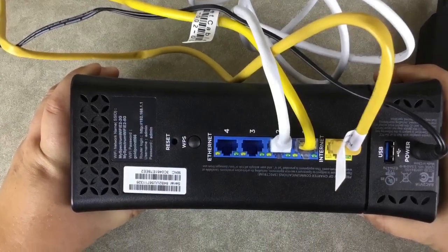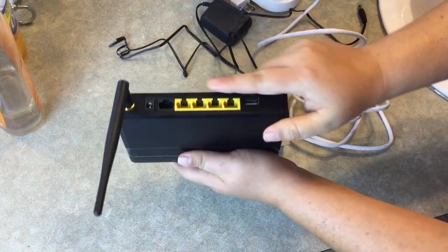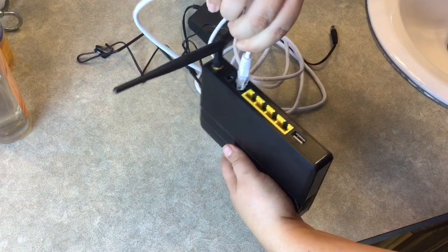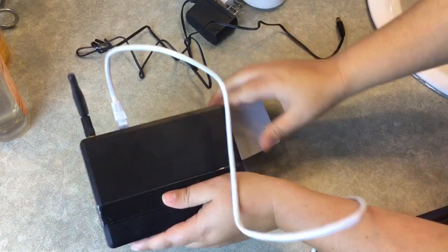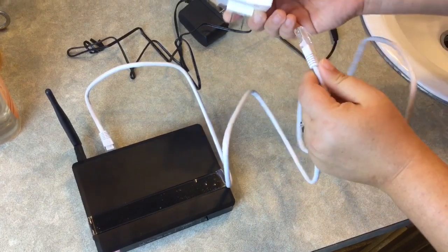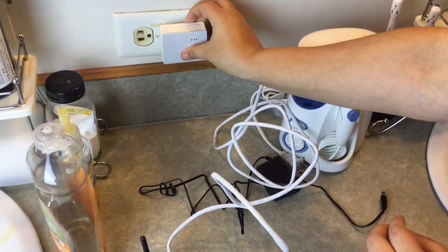Now take your Next Stage supplied router and second wireless extender within 30 feet of your treatment location. Plug one end of the ethernet cable into the black WAN port on the back of your Next Stage supplied router. The other end of the ethernet cable will be plugged into the bottom of the white box. Now plug the white box into an electrical outlet.